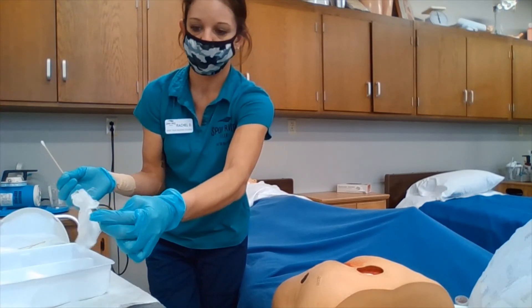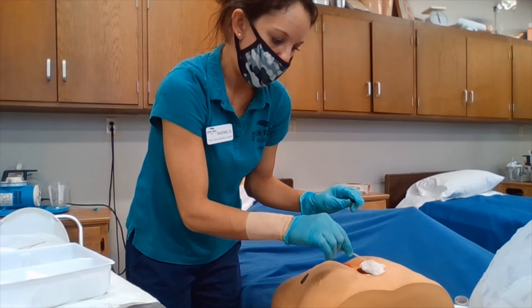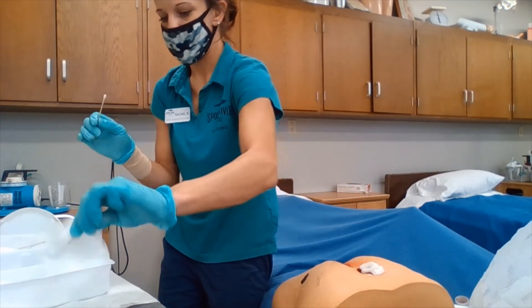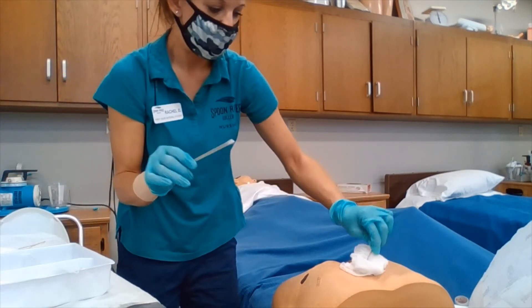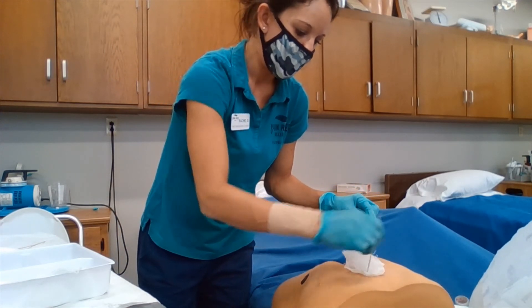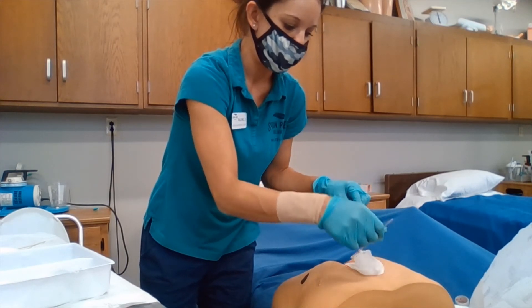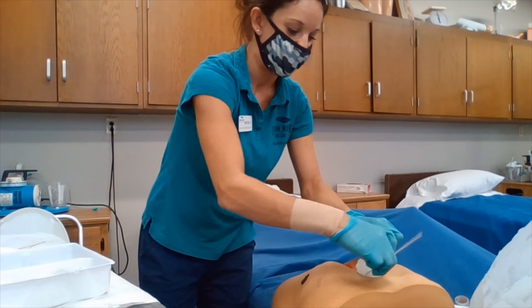We are going to place the gauze in the wound and ensure that we are also placing the gauze into any crevices of the wound. After we have finished with our first layer, we are going to be applying a second layer. We also want to make sure that we are not packing the gauzes too tightly into the wound. Once we have all of that done and our second layer is on, we are ensuring that it is not packed in there too tightly.